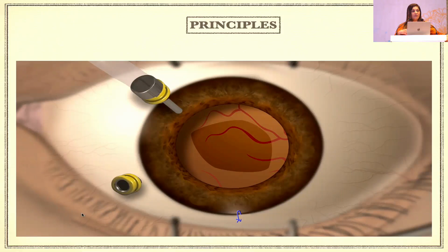At this point, I would like to ask the audience how many of you are doing a vitrectomy with the vitrectomy probe whenever you have a complication? Okay, so we have quite a few people. And is there anybody who is still using the scissors? Because all those people who have not raised their hands, I don't believe you don't have a complication. Everybody has a complication at any point of time.